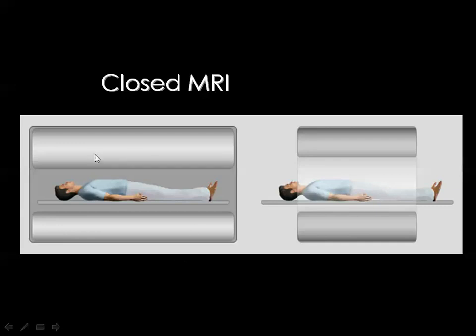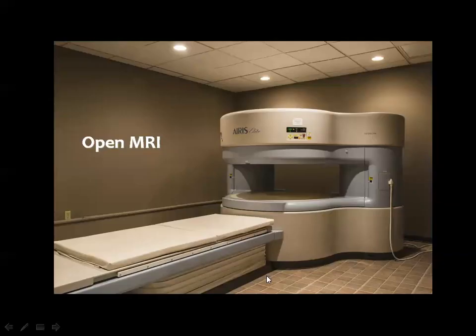Then they made some changes in the magnet to allow the patient head free and also the patient feet, but this did not add too much to the acceptance of the magnet. And at that time the open MRI has been introduced to the clinical practice.